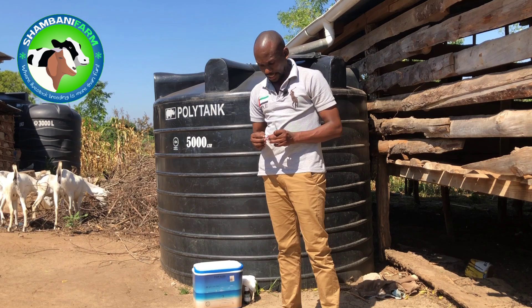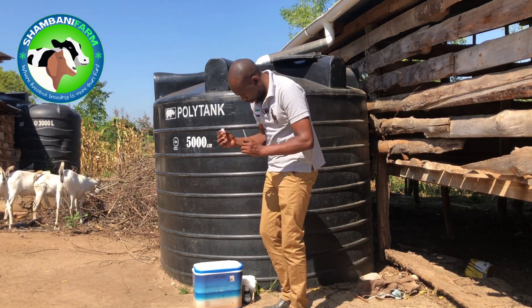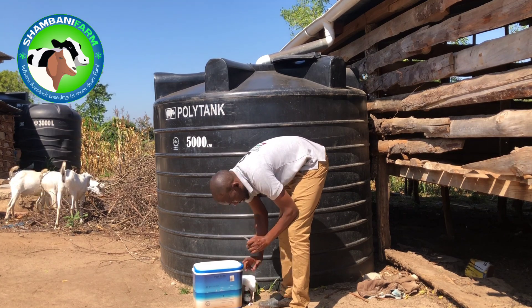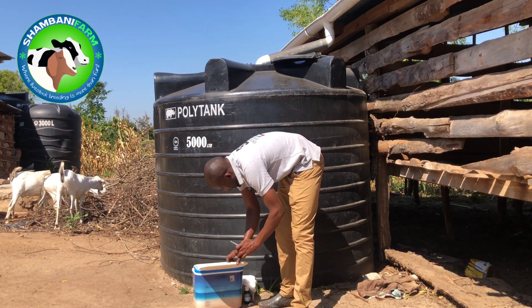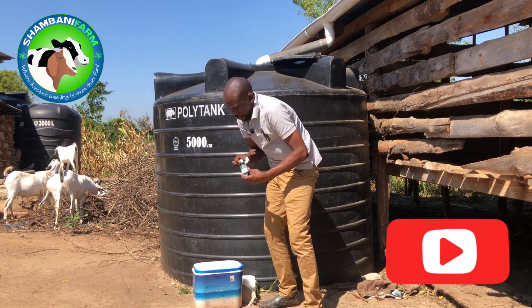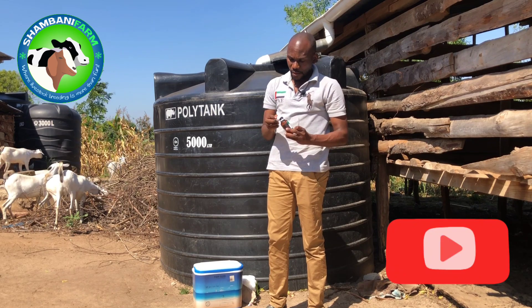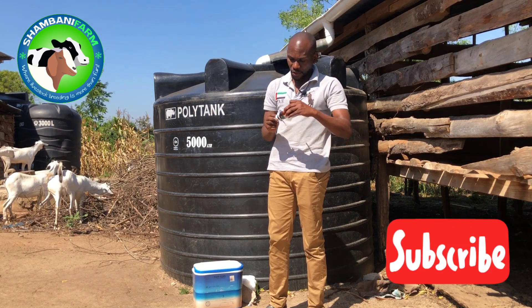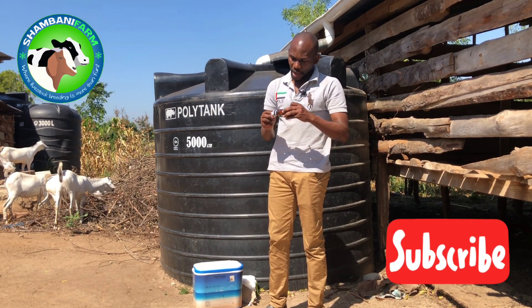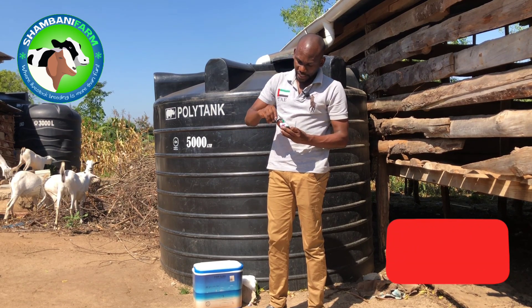Since I've used the previous syringe I'm going to dispose of it and take another one. Then I go into my methylated spirit container and dip the cotton wool in there.